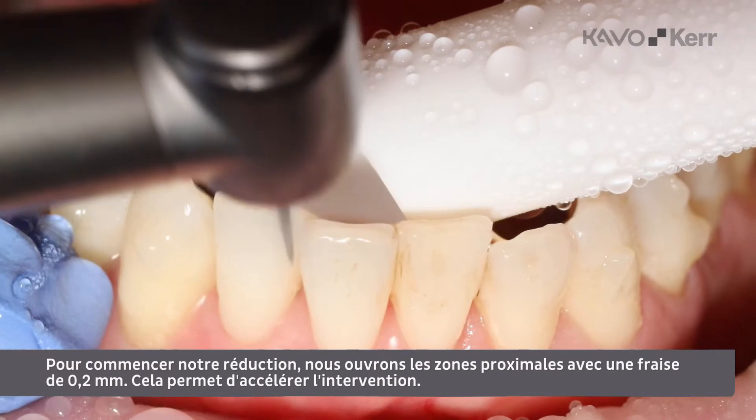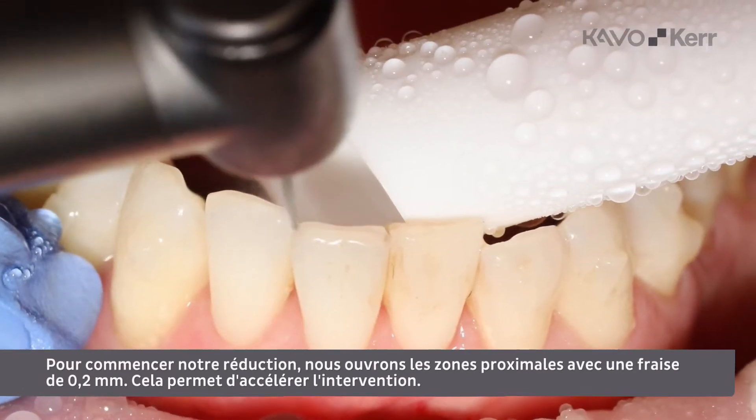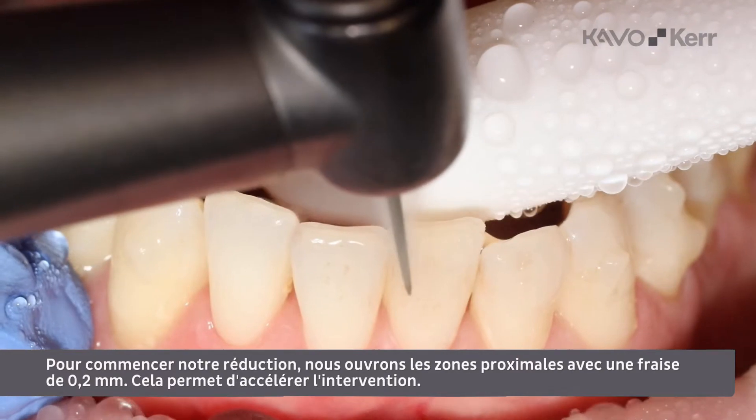To begin our IPR, we open the proximal areas with a 0.2 mm burr. This will speed up the procedure.